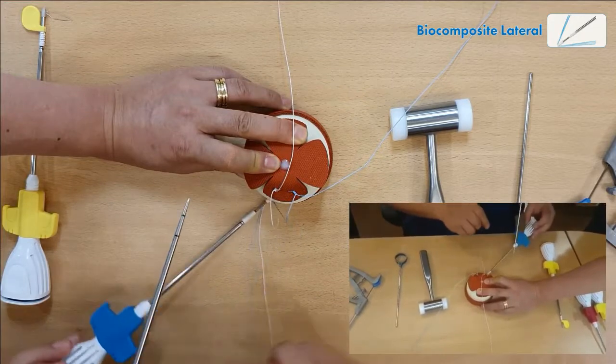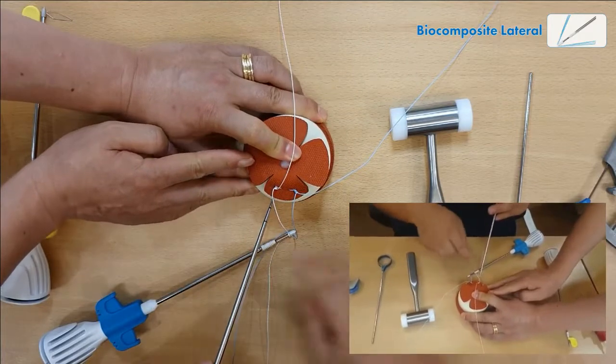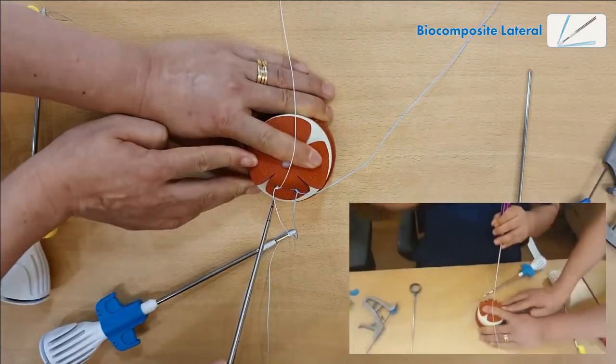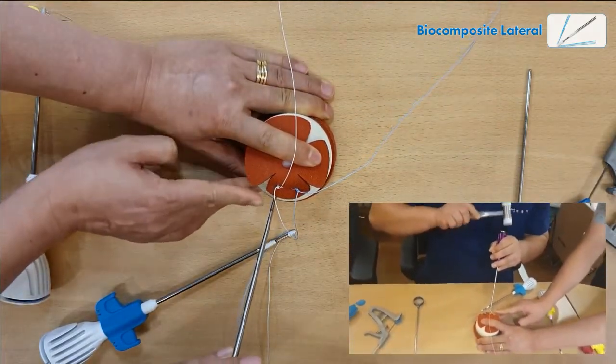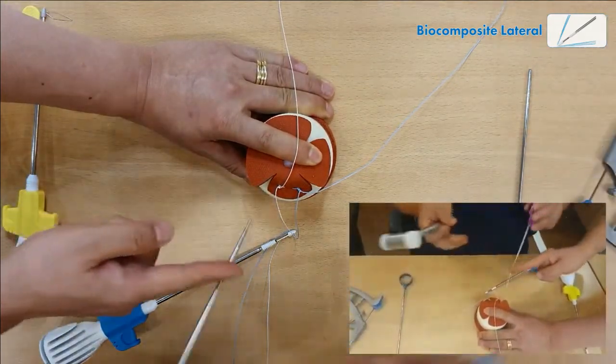Now, this one is tapping, so I'm going to tap it just about an inch where the indentation mark is.